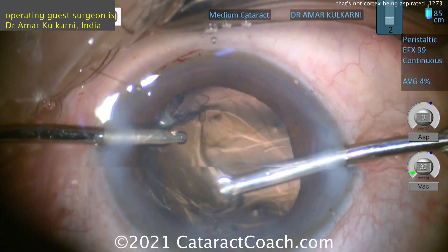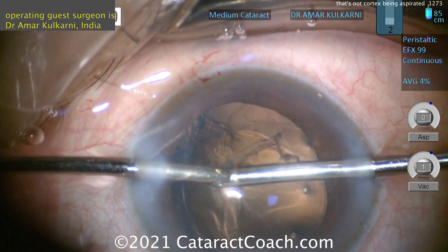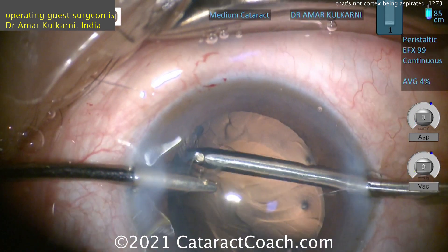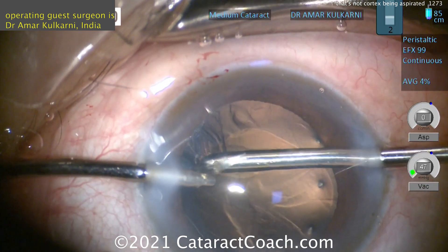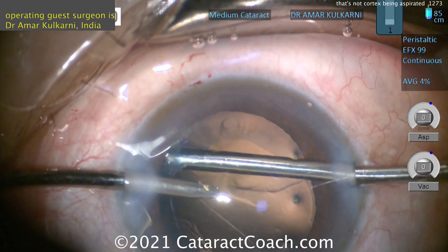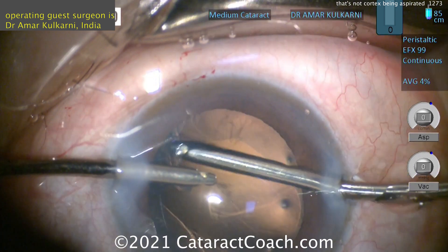If you need more, use it. So taking out that last bit of cortex — you can also decrease the fluidic settings during cortex removal. Decrease the inflow, decrease the outflow, so you don't remove so much of that viscoelastic because you want it there. I'd let go of that. I would let go of that, my friend. Let's leave that be.